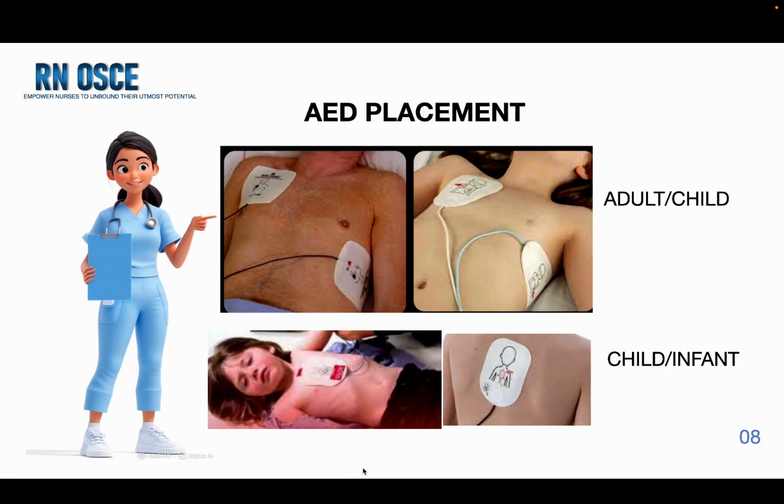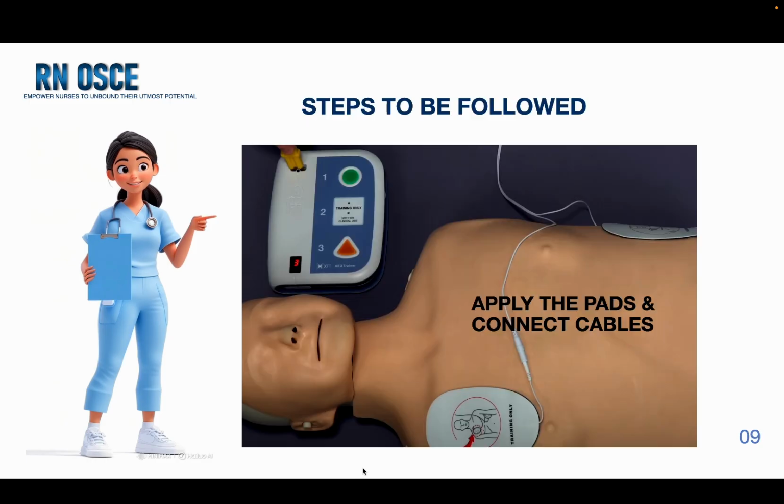Apply pads to patient's bare chest. Plug in pads connector next to flashing light. Once you hear the audio prompts, you are supposed to apply the pads and connect the cables as given in this picture.